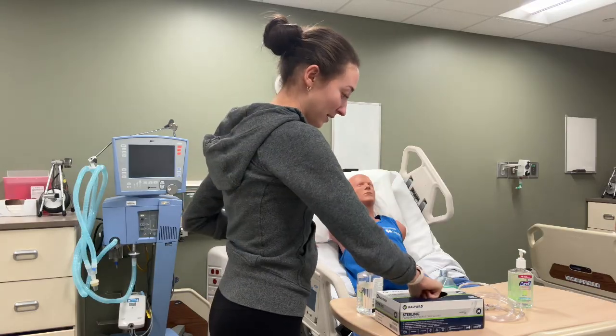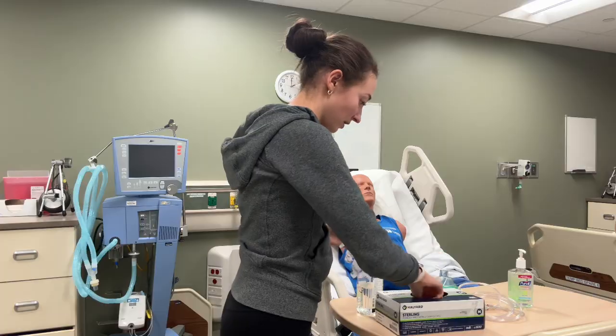I'm going to decontaminate my hands and put on some gloves before I begin.